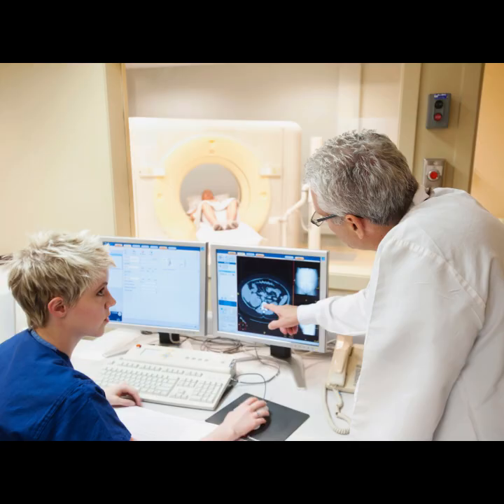But that very rigidity guarantees spatial accuracy. We know, based on basic Nyquist principles, that the desired spatial resolution is directly determined by the maximum extent of K-space we sample. And the field of view is dictated precisely by the K-space sampling interval, the delta K. We can write the pulse sequence, and we know exactly what image quality metrics we are going to achieve. And, importantly, we have powerful physical methods to fight that tyranny of time within that rigid framework.